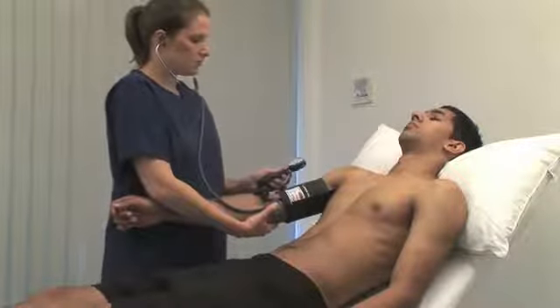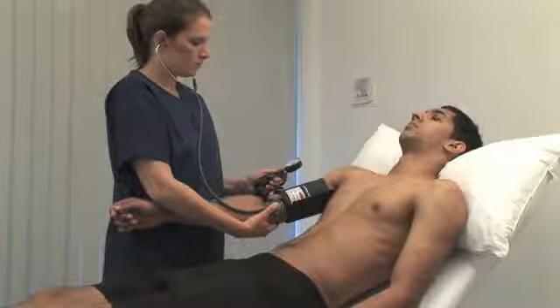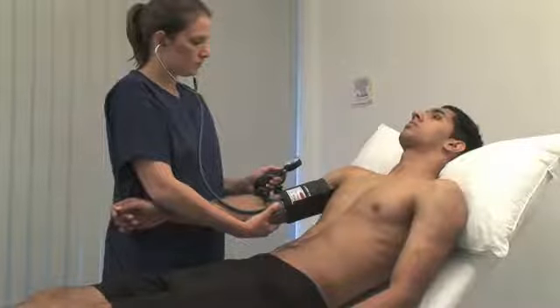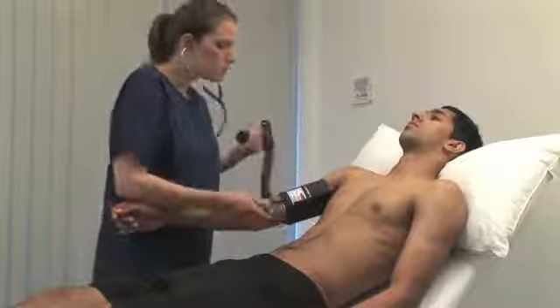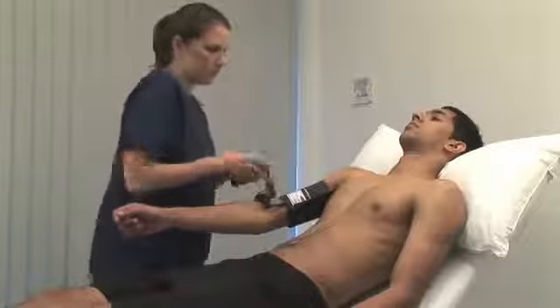Note the reading when you start to hear a regular tapping sound. This is the systolic pressure. Continue to deflate the cuff slowly. The point at which sounds are no longer heard is the diastolic pressure. More subtle features of the Korotkov sounds are described in the book.